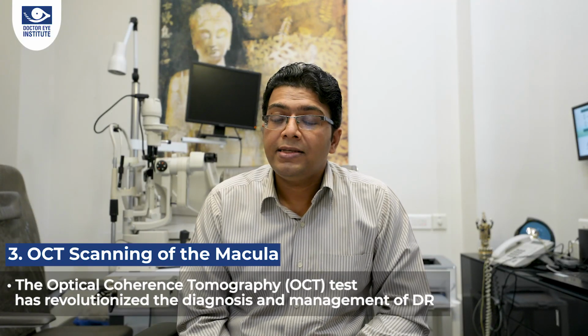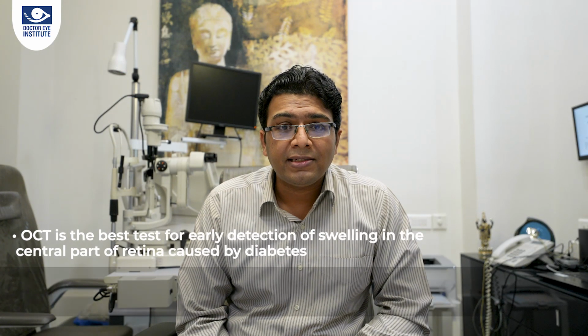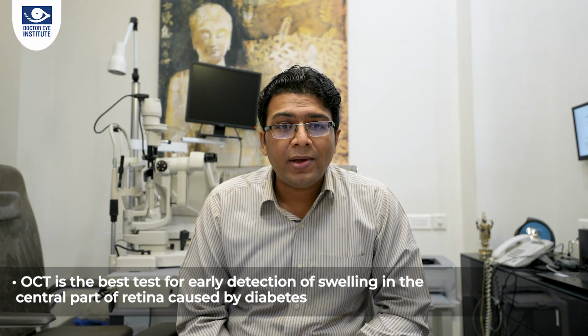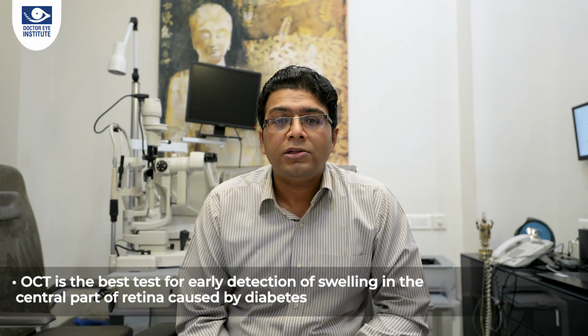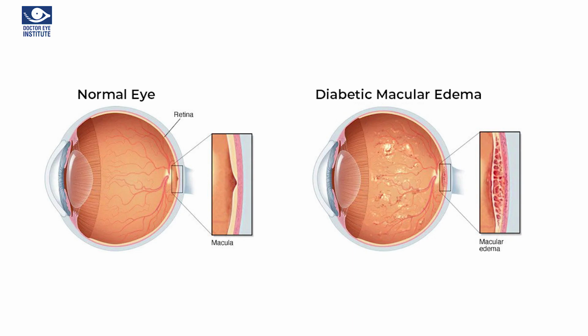The OCT or the Optical Coherence Tomography is a test which has revolutionized the diagnosis and management of diabetic retinopathy. It is the best test for early detection of any swelling in the central part of the retina caused by diabetes. As you may recall from our previous video, diabetes causes the normal blood vessels of the retina to become leaky, causing leakage of fluid and cholesterol, and thereby swelling in the central part of the retina. This causes blurring of central vision and sometimes even distortion of objects.